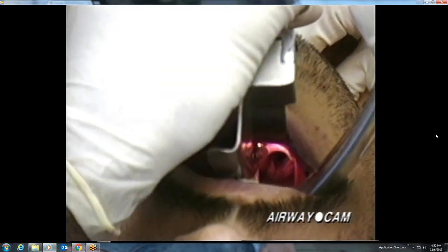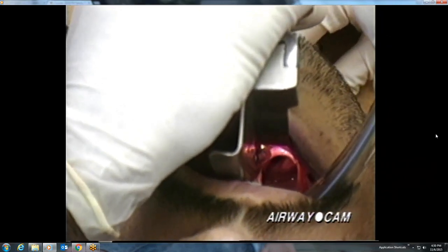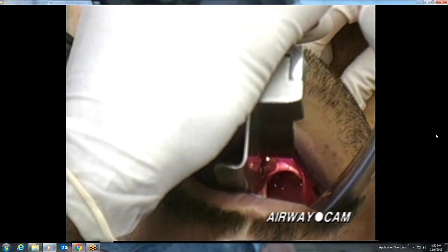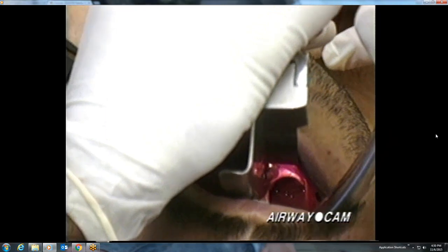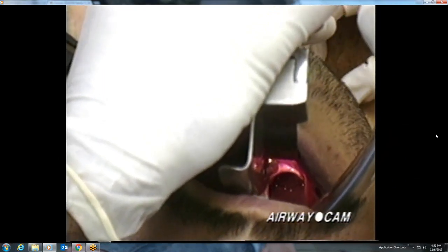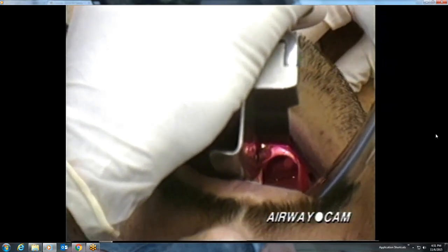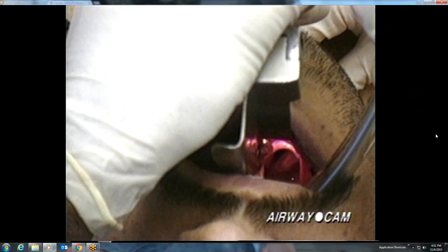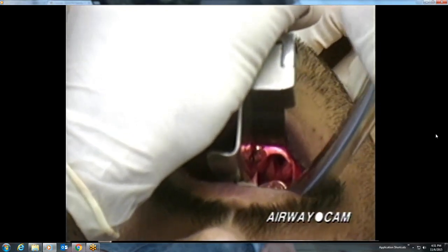Using slow motion, let's take another look at the effect of laryngeal manipulation in this patient. Note how the epiglottis is brightly lit, positioned directly in front of the light source on the curved blade. An assistant moves the larynx and posterior cartilages in a posterior direction with manipulation of the thyroid cartilage from the anterior neck. The glottic opening is relatively dark, and the true chords are not seen because of the shadowing by the epiglottis. Nevertheless, the posterior cartilages and interarytenoid notch clearly mark the entrance into the larynx.